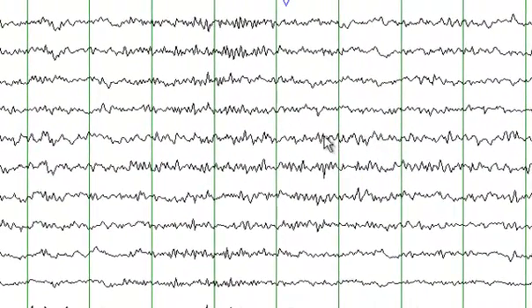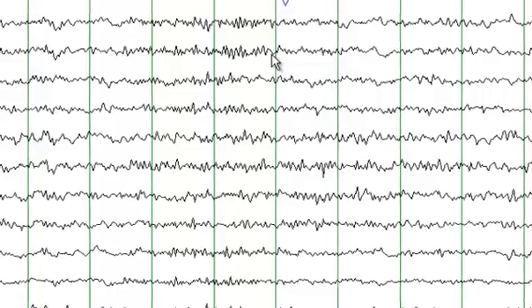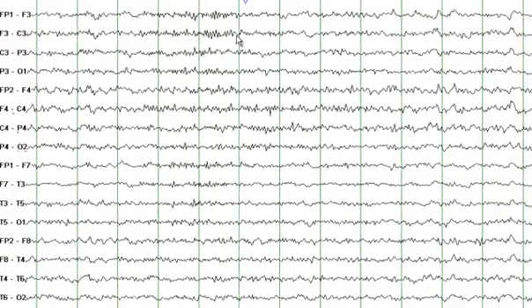On this page specifically, you see a lot of fast frequencies — these are beta frequencies between these two green lines. If you count all these waves, you will find that these exceed 13 waves per second.